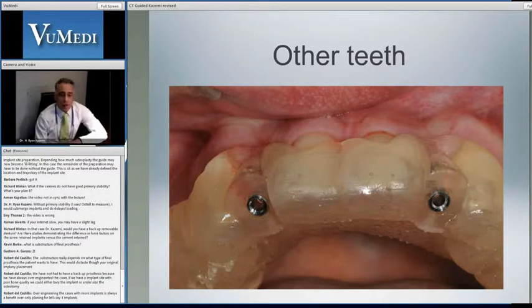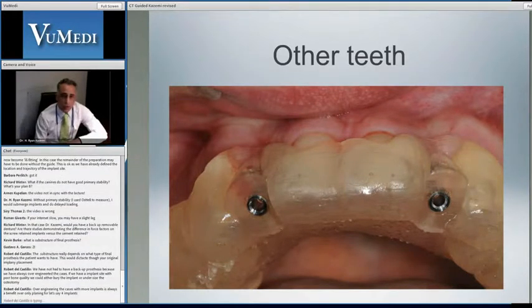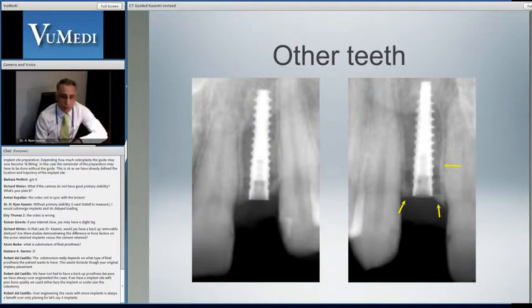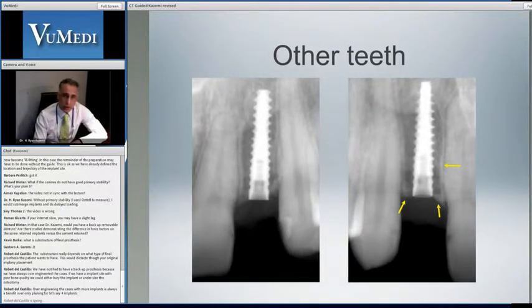safely. From our three-dimensional workup, we'll create a tooth-borne surgical guide to delineate our exact plan. We place the implants, and we have adequate space between the implant and the teeth, as well as the crestal bone, which will be extremely important in the preservation of the papilla and the soft tissue, and ultimately the aesthetic and the functional result.